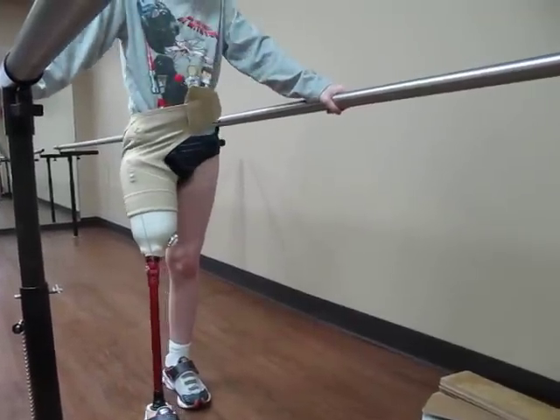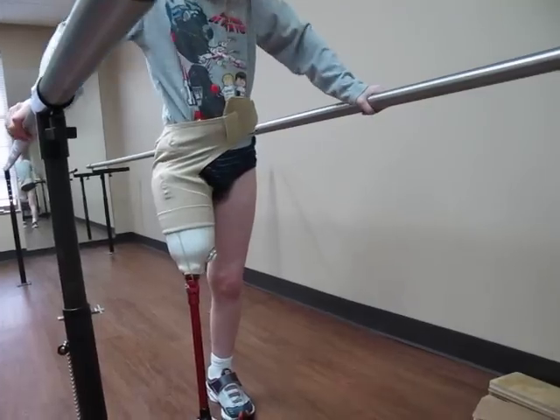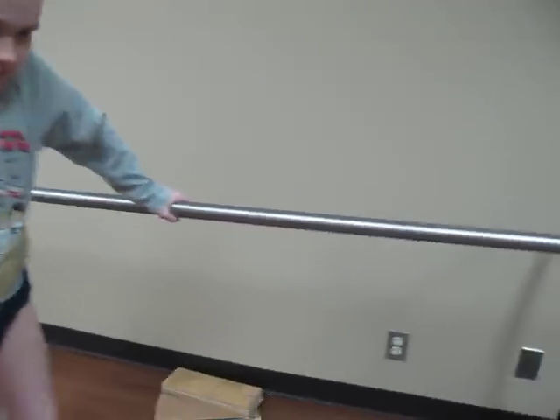Trimmin'. What? Who? What are you talking about? How's it feel? Good. Does it feel better? Yeah. Son, you're doing so good.